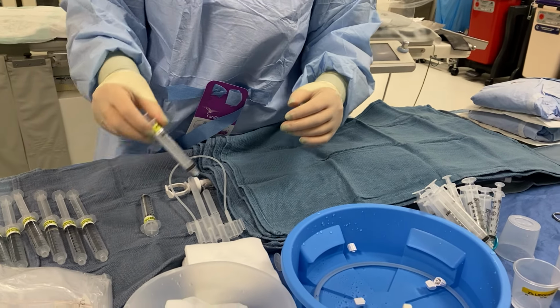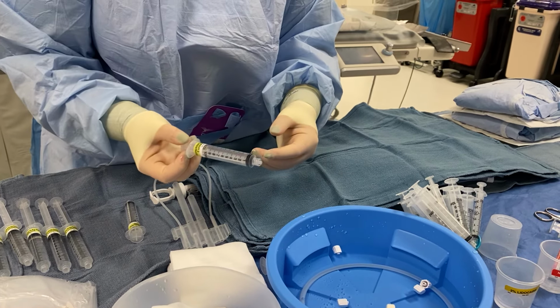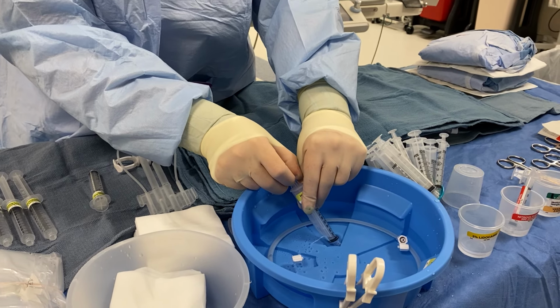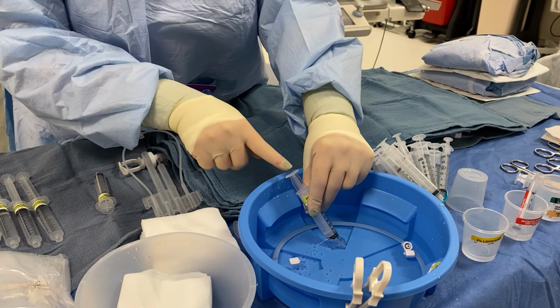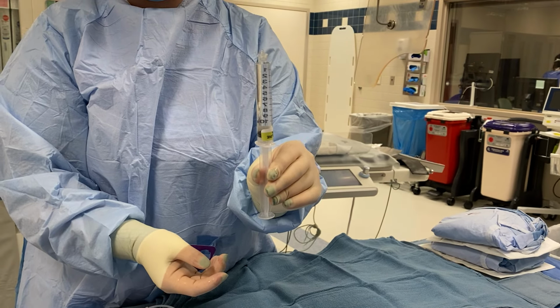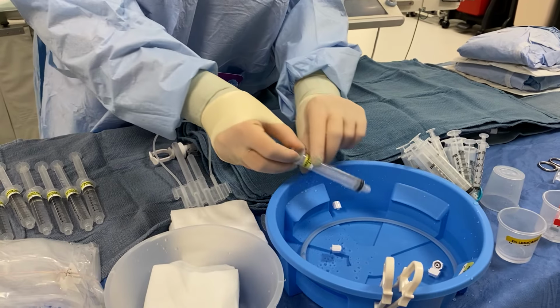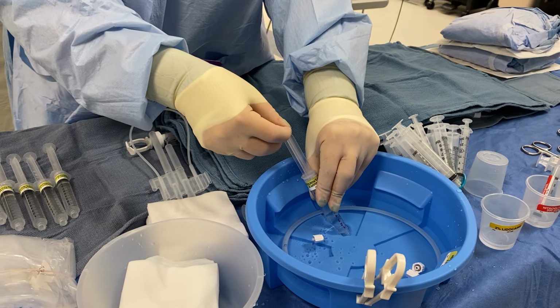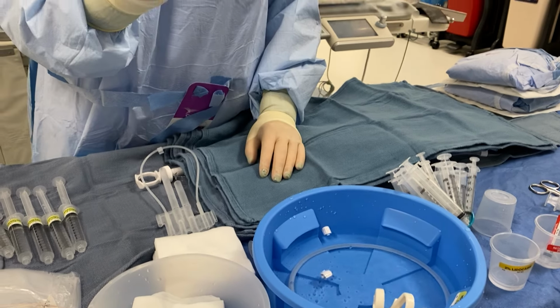And usually I find the best way to draw up saline without getting any air in it is I'll draw a little bit up, usually about a cc or two, and then I'm gonna push it all the way back in, and then draw up a full syringe. And you should have no bubbles. Just like that.